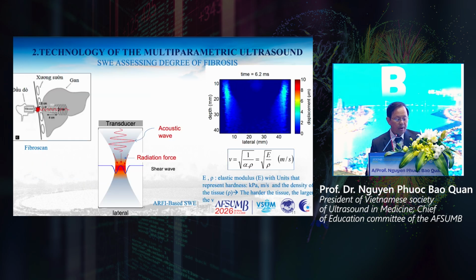I will talk about the branches of elastography. In this slide, you can see the branches. We have a technique to follow shear wave propagation in the liver, so we can measure the elasticity of the liver.